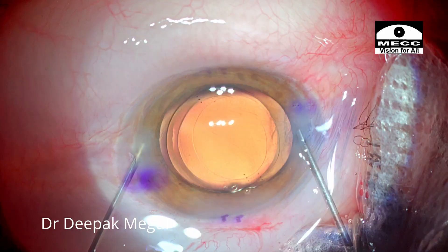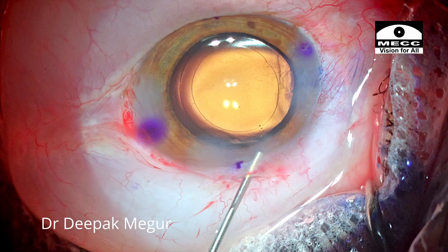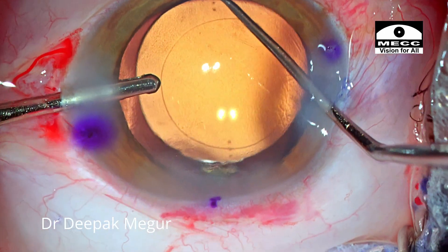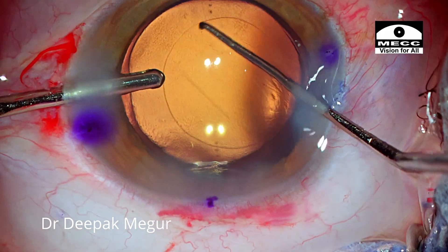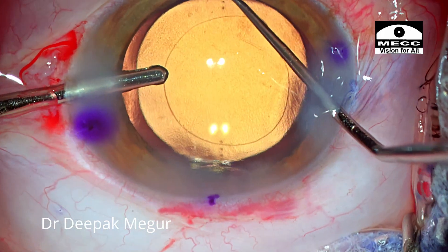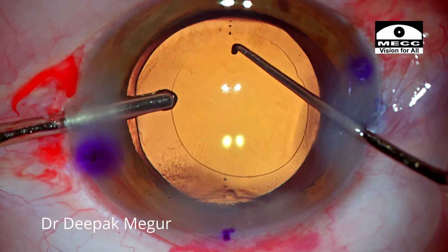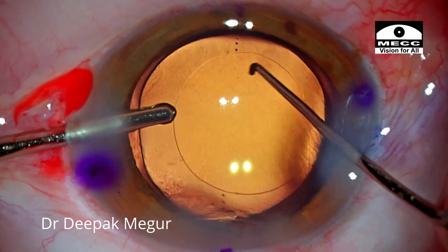Before doing the final alignment, I hydrate all the ports. The final alignment is being done now. Looks to be fine.